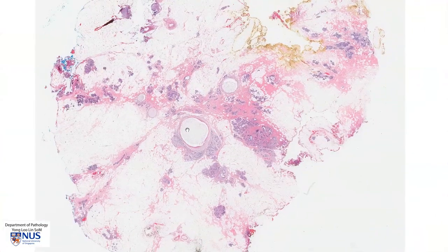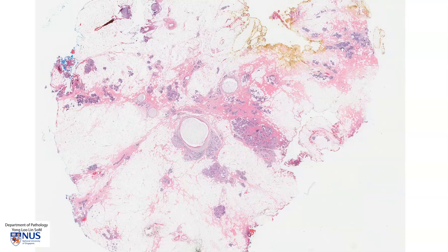In summary, this is an example of fibrocystic change in the breast. This is a benign condition as long as there is no significant atypical proliferation within the ducts or lobules. We have the cysts, we have the stromal sclerosis, and we have the focal areas of adenosis. Thank you.